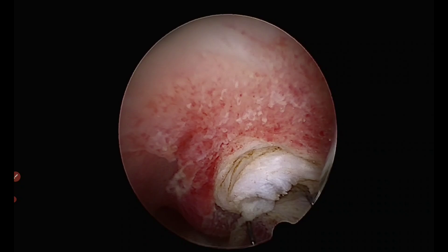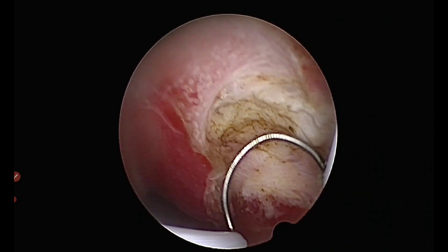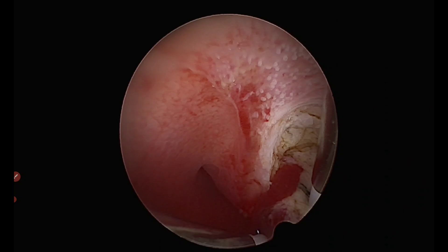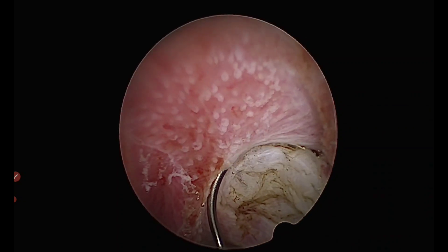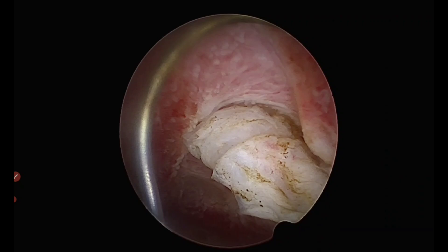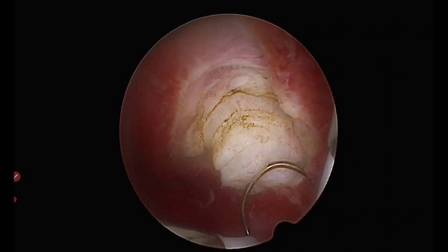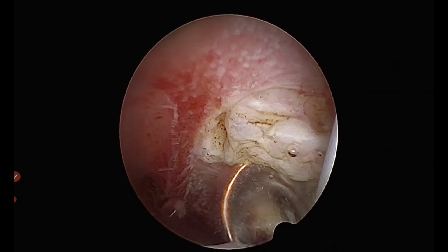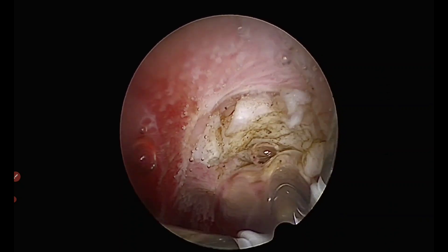The fibroid is now bulging beautifully into the endometrial cavity, making it very easy to take cuts and shave pieces that would otherwise have required going inside the uterine wall. Placing the loop at the base of the fibroid at the pseudo capsule and applying a slight burst of current causes the fibroid to move closer to the endometrial cavity. At this stage, my hand can actually feel the mass of the fibroid moving separately from the myometrium — a tactile sensation. As the fibroid gets resected, the myometrium behind it starts coming into view.